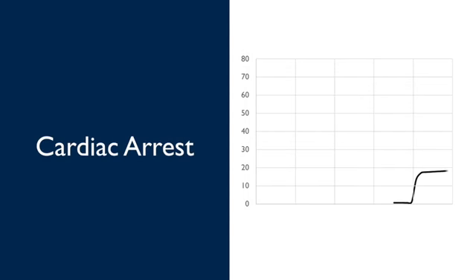Once you start CPR, you should be restoring pulmonary perfusion to some degree, and this should be reflected by an increase in your end-tidal CO2. This can also provide a goal for you. You want your end-tidal to be at least 10, if not greater than 15. And if you notice that your end-tidal CO2 is drifting downward, such as in this case, it's probably time to change out the person doing CPR. On the contrary, if you notice a sudden increase in your end-tidal CO2, then the patient probably regained a pulse.